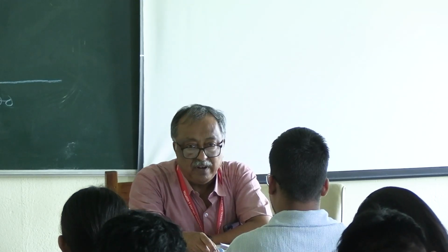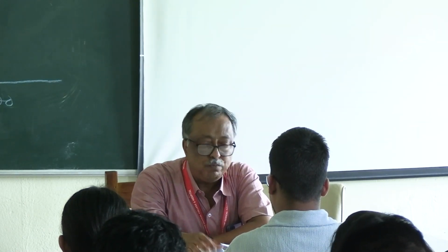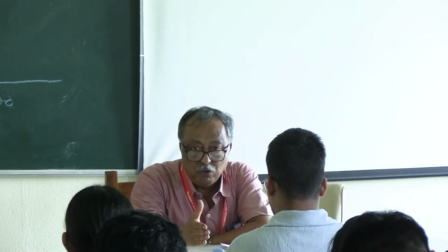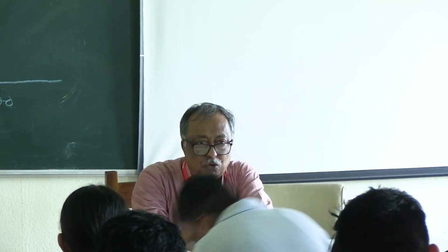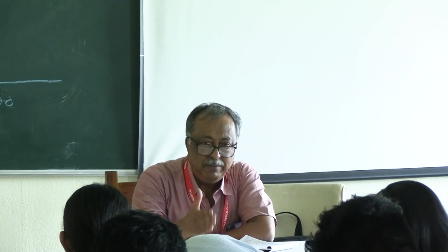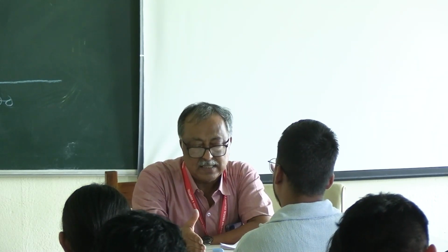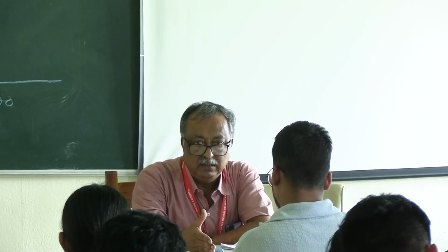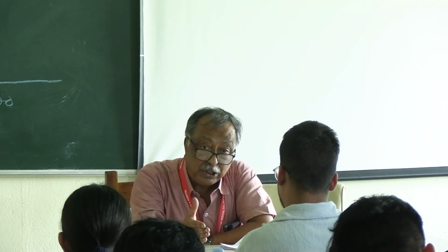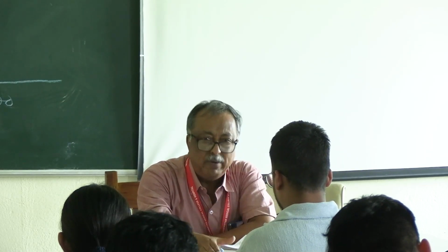Speech audiometry generally, I will come to the speech audiometry later. It is 30 to 40 decibel sensational level. When you go for the speech audiometry, not the pure tone audiometry, that means a conversation, maybe whisper, maybe normal conversation from a certain distance or by a machine, and a definite type of word, the sensation will be produced 30 to 40 decibel above the pure tone audiometry sound.